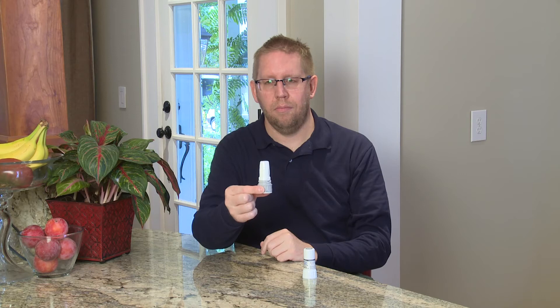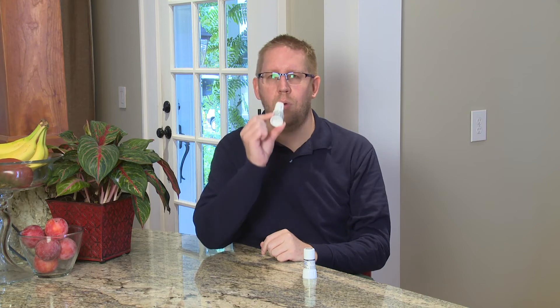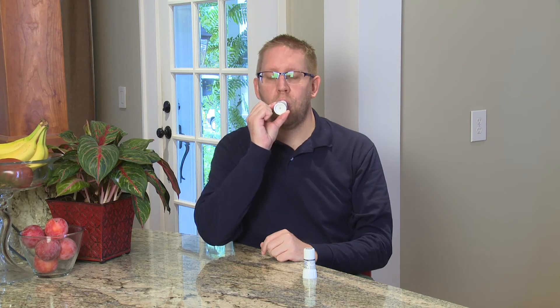When you're ready to begin your treatment, blow all the air out of your lungs slowly. Next, place the twist haler mouthpiece in your mouth and seal it with your lips. While sitting up and holding the twist haler by the base, take a slow deep breath through your mouth.